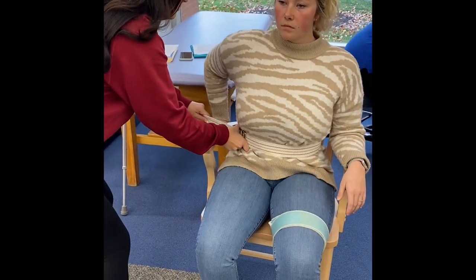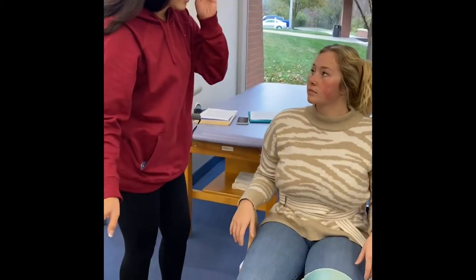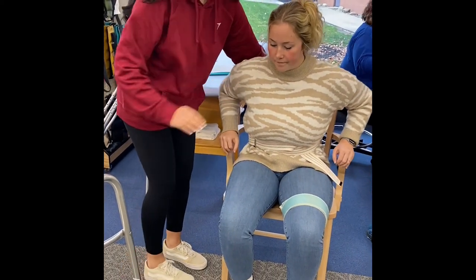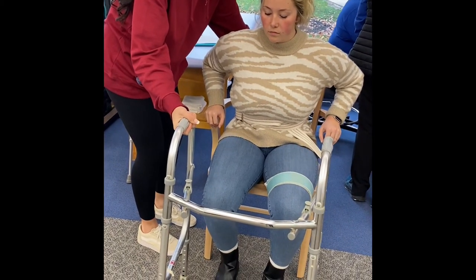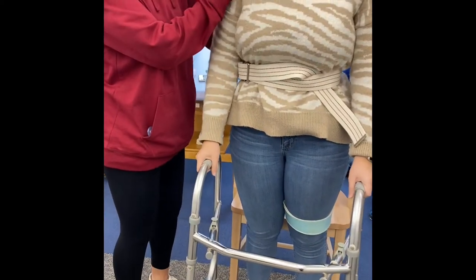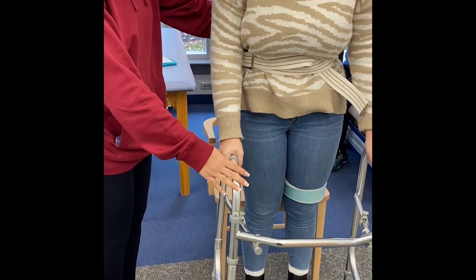Is that okay if I reach behind here and grab underneath the belt? And then I'm going to also place this here — is that okay? And then we're going to get you stood up. Once you're standing, you can grab onto the walker. So you're going to lean forward, and then we're going to push up with your legs and your arms. One, two, three. Are you dizzy at all? No. All right. So you're going to want to place the back of the legs at your midfoot, and then you can relax your arms for me.